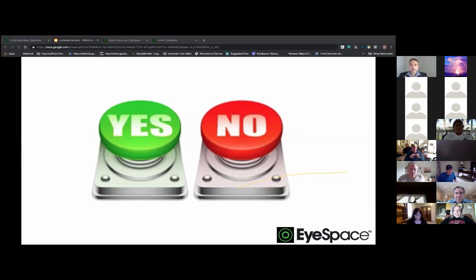Again, dealing with the -6.50, you can appreciate if you follow that half rule, the next day there might be a -3, -3.50, so that's not functional vision. How do you manage that patient through that transition phase? Same with the astigmatism. We know these higher minus cases can take anywhere from 2 to 4 weeks before they resolve and get to the final point. I say to patients, it's like making red wine. The longer we wait, the better the result. So just hang in there. This takes a while to gain experience working in this realm.